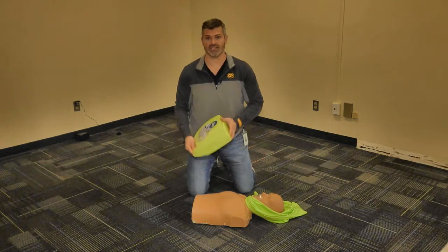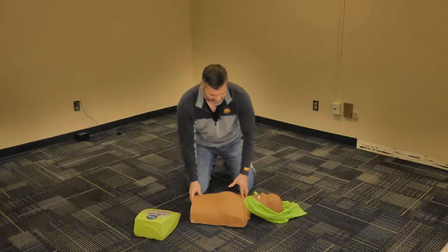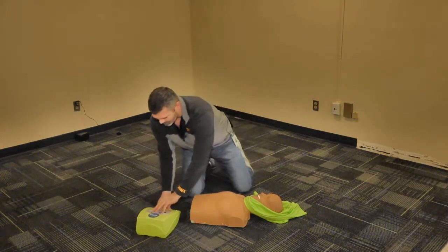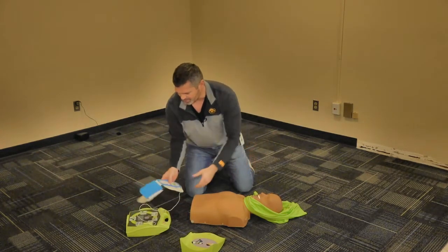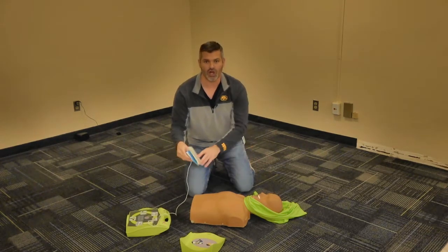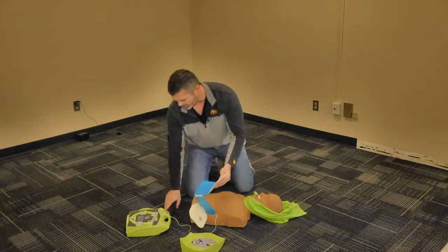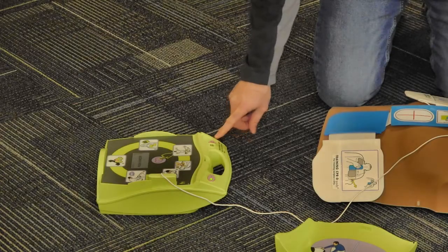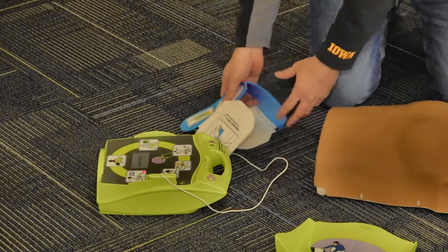After you retrieve the AED from the stand, you place it on the ground next to the victim. Open up the AED and you will see these pads here. But the first thing that a lot of people forget is to turn on the AED first before you actually put the pads on the patient. So press this on button, listen to the prompts, and stay calm — that's the main thing.